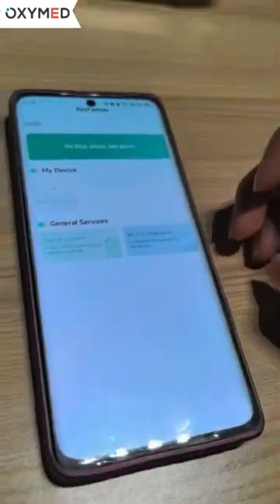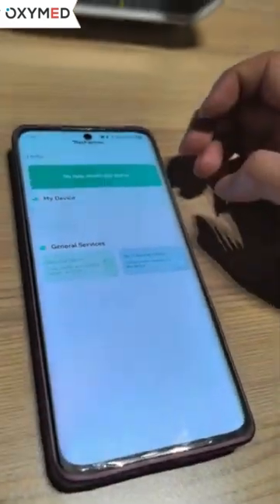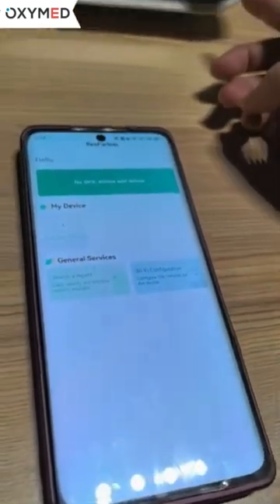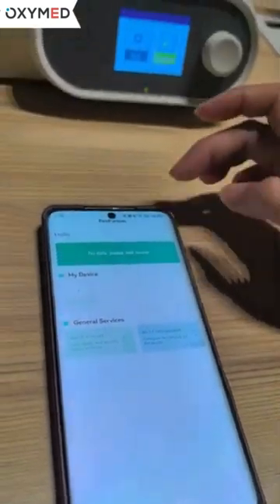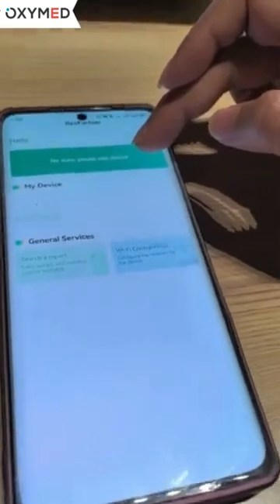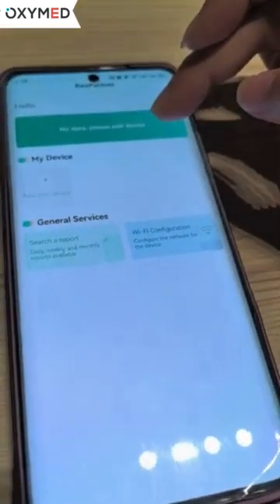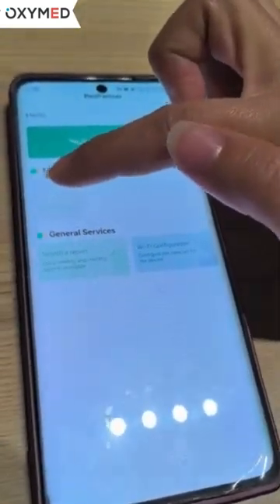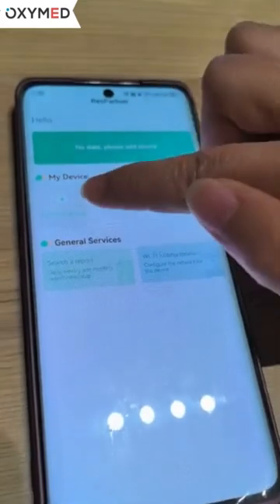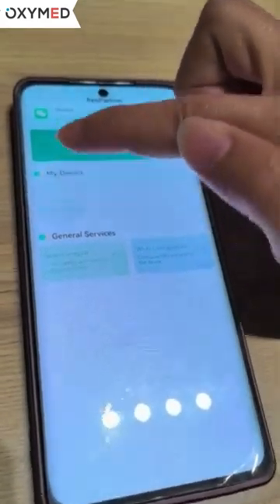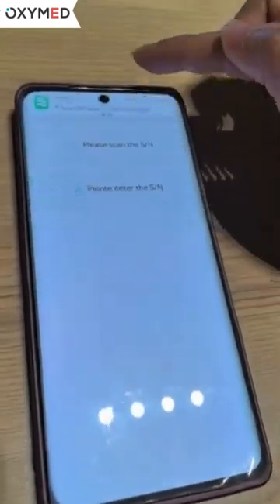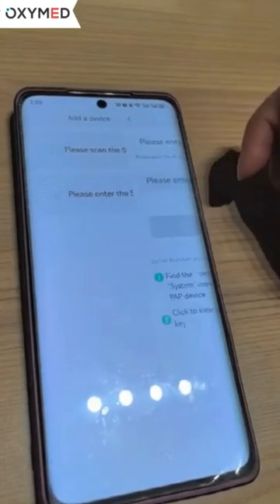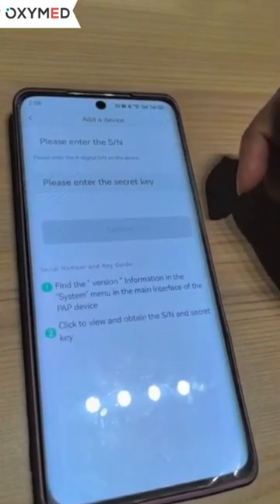To connect the Wi-Fi with the app and our device, first we need to enter the partner app. Next, we click 'My Device' and then 'Add New Devices'. Then we choose to enter the sign number and the secret key.